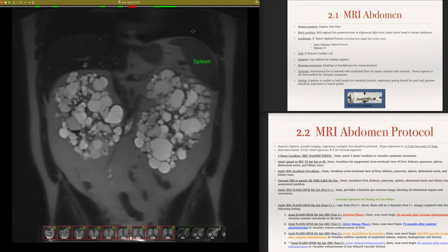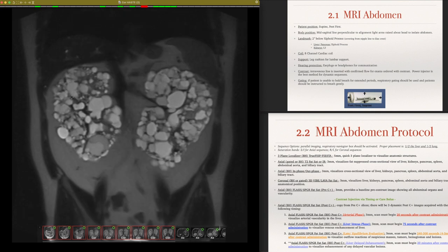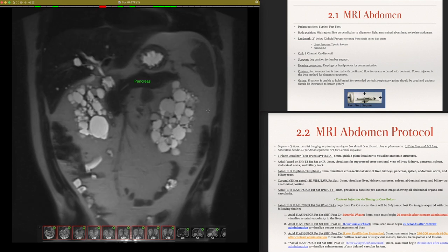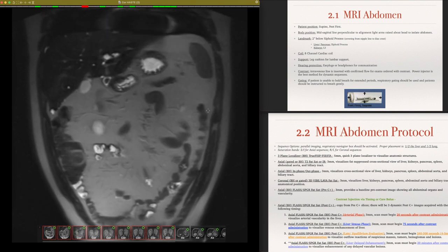Okay, kind of coming through. You have your spleen here to the left side of the patient's body. This actually seems to be a little bit larger, so splenomegaly here. And we can definitely shout out these large kidneys with fluid-filled cysts, right kidney, left kidney. Okay, so as we scroll through, we'll see the pancreas pop in.